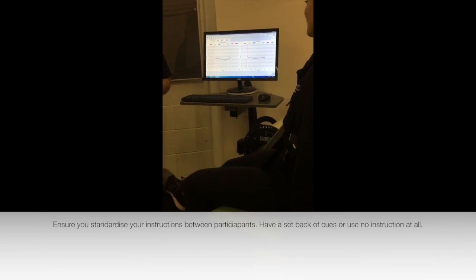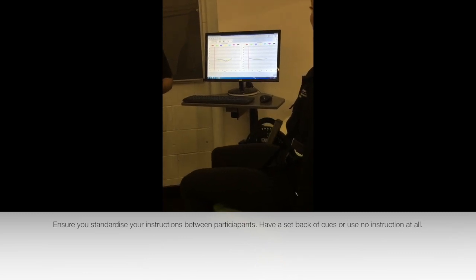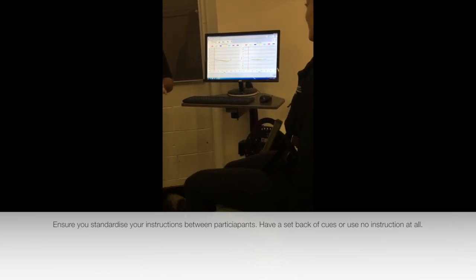Verbal feedback in isokinetics is also being shown to have an influence. So you either give none, or you give lots.